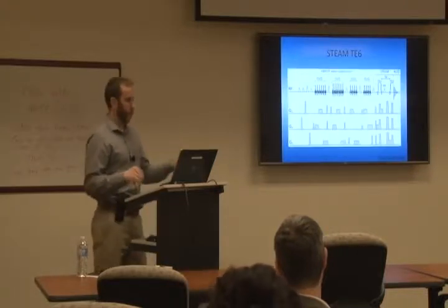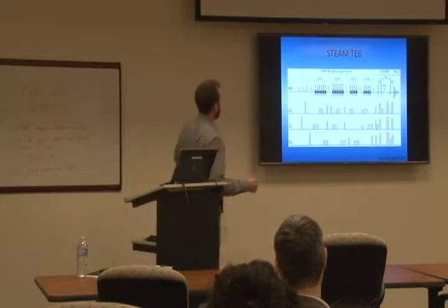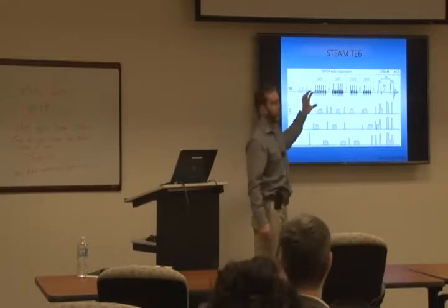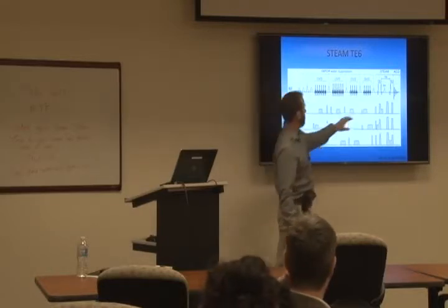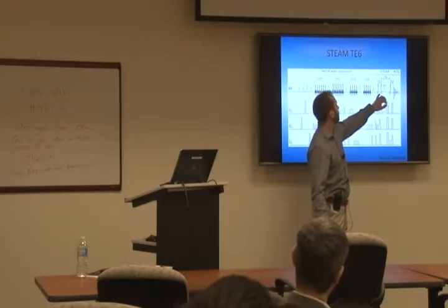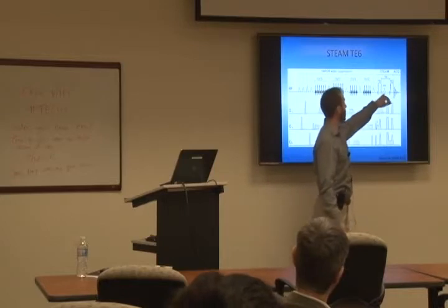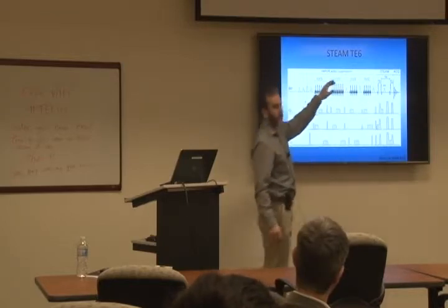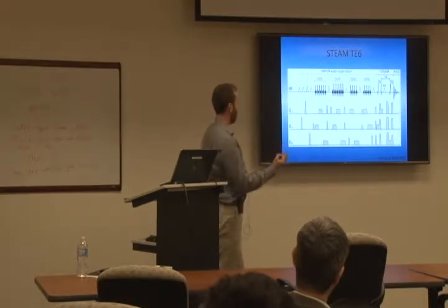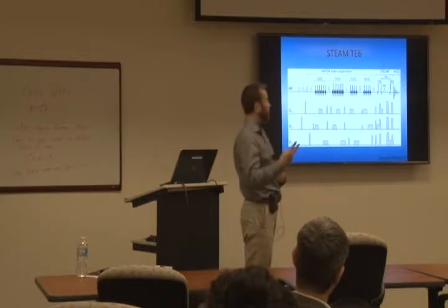So I'm going to use this one. This is the STEAM, but it also has the same water suppression module that we're using. It has different flip angles. So this is a 90 degree, and then in STEAM it's 3 90 degrees, but in PRESS it's 90, 180, 180. And so that's, I put in 3 optimization steps, which we reduced to 2.